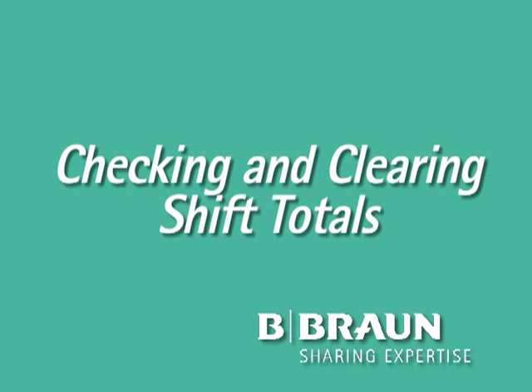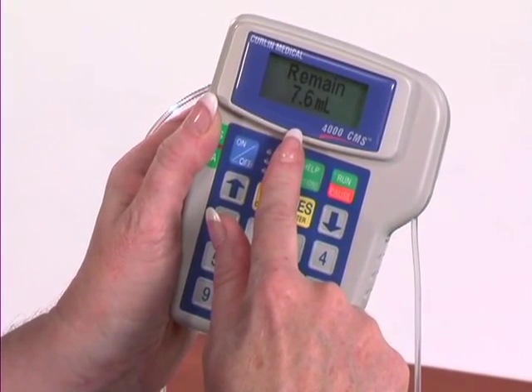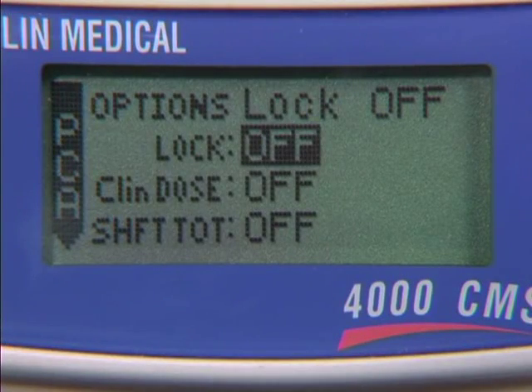Let's now check and clear our shift totals. Once again, that is found in the Options menu. Before you enter and clear the shift totals, record the remaining volume in milliliters from the main screen. Press the Help Options button to enter the option menu.